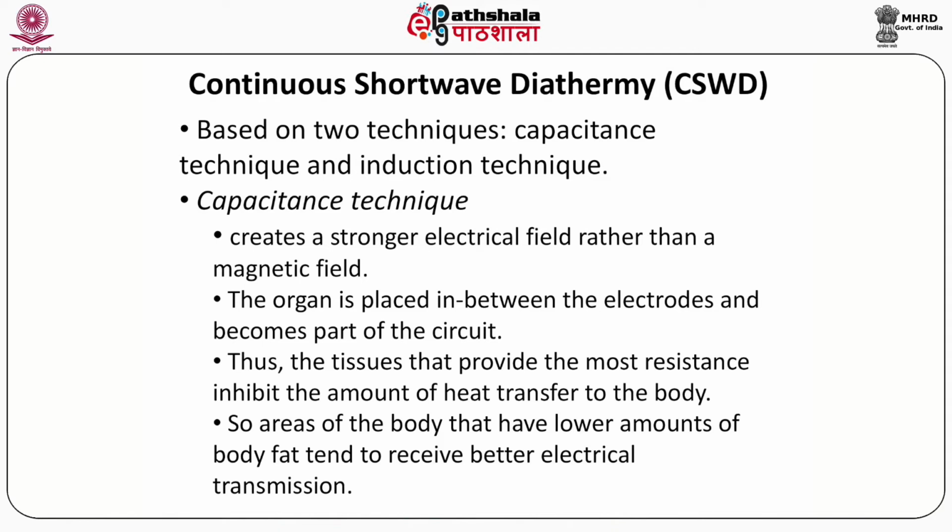One is continuous shortwave diathermy, another one is pulsed shortwave diathermy. So first, talking about continuous shortwave diathermy, it is based on two techniques. One is the capacitance technique and another one is the induction technique. Talking about the capacitance technique first, it creates a stronger electrical field rather than a magnetic field.